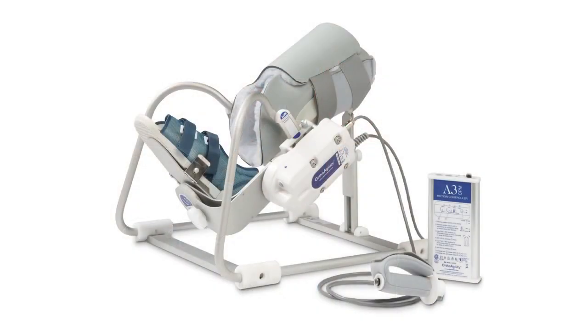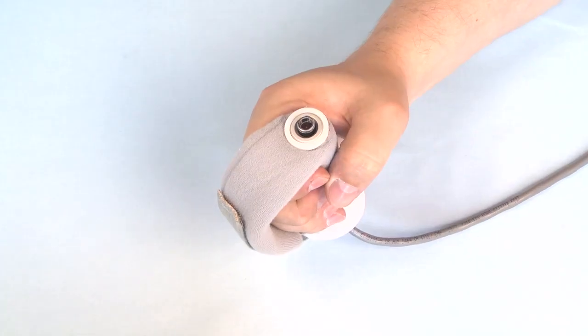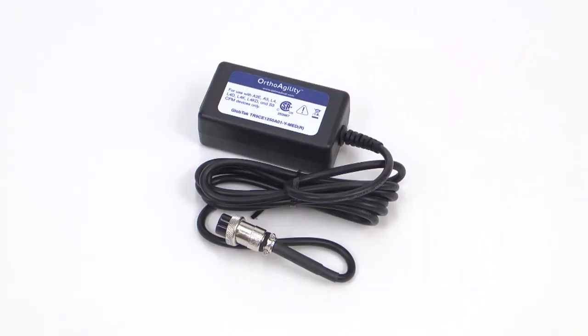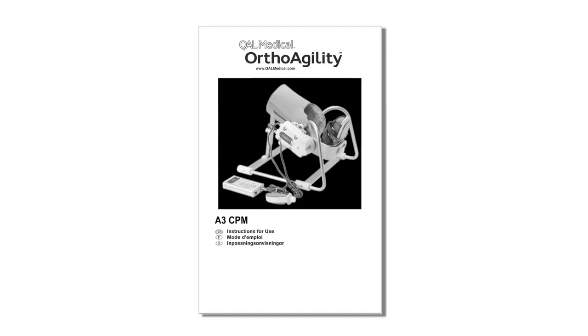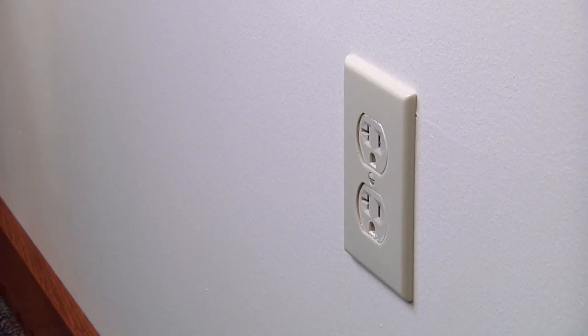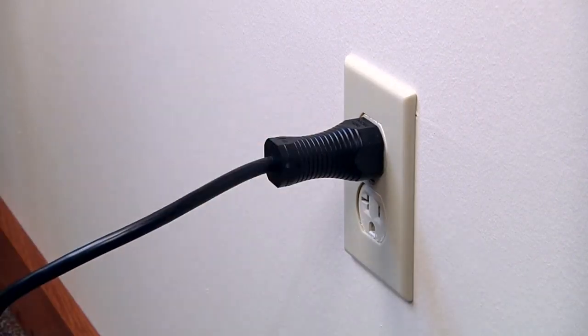Each OrthoAgility Ankle CPM comes with a CPM unit, programmable motion controller, patient-controlled on-off button, power supply, soft goods kit with an option of two sizes of orthopedic shoes, and directions for use. Begin setup by plugging the programmable motion controller into a grounded wall receptacle.